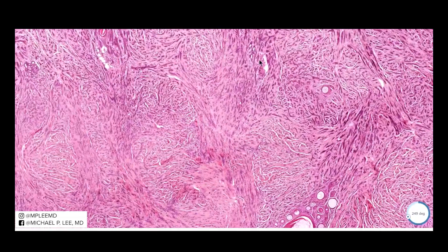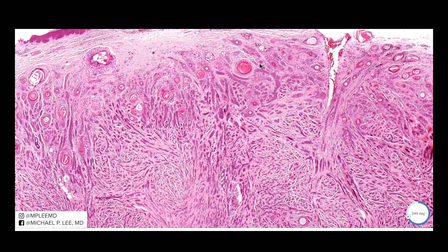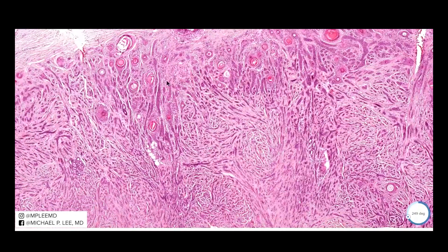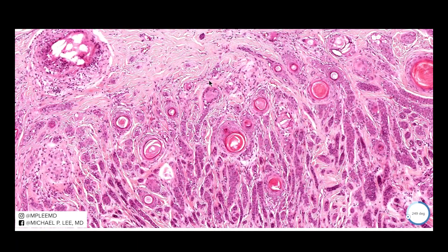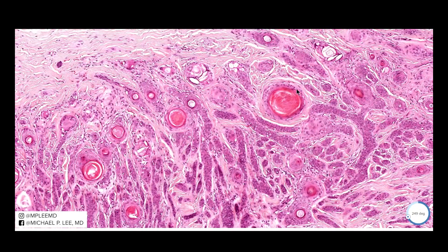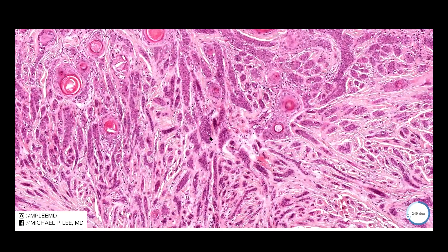There is some follicular differentiation with these horn pseudocyst-like structures. If you look closely, we also have these paisley-tie-like structures. This is a biphasic tumor, and that's the first thing that should tip you off toward the right diagnosis. When we see structures like this, we typically think about things like syringoma, which is a common differential in this lesion. And then we have these follicular horn pseudocysts present — so that's the initial tip-off.